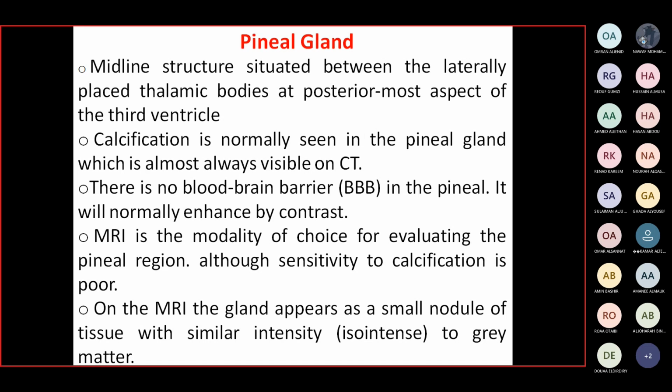The blood-brain barrier prevents enhancement of normal structures by contrast, but when there is no blood-brain barrier, the structure may be normally enhanced by contrast circulating in the blood.